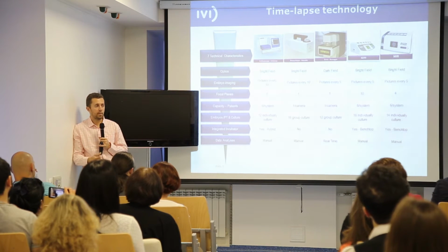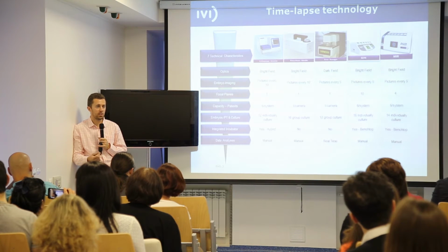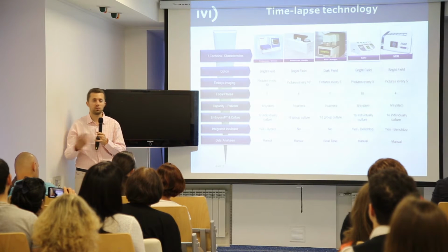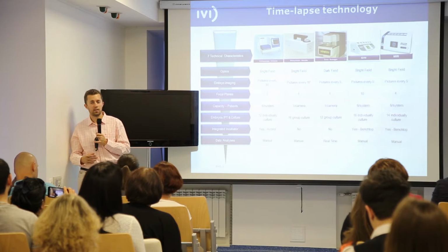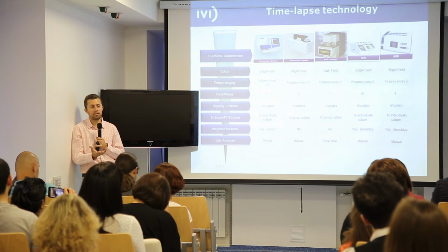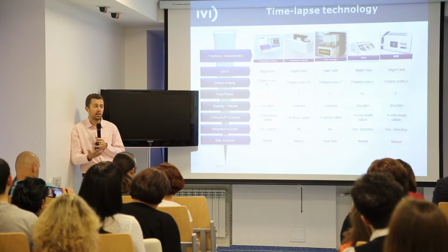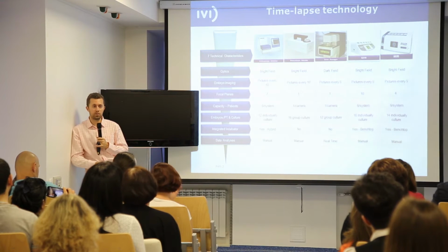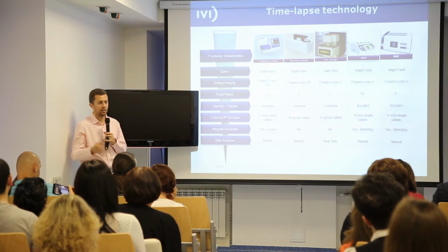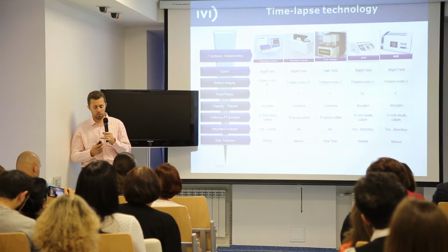Maybe you have different focal planes. The number of patients per machine is slightly different. The number of embryos that you can analyze per machine is between 12 and 16, so the total number of embryos that you can analyze can also change from one machine to another. But more or less, the technical things are slightly different, while the information, the way of using it, and the benefits are similar independently of the brand that you purchase. And there are other important factors, like the brand, the money you have to spend, who is selling the machine, the technical service, etc.